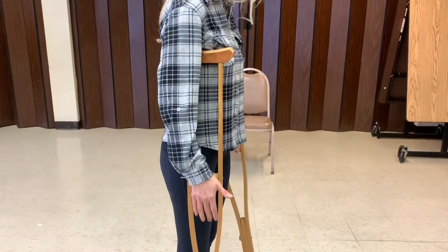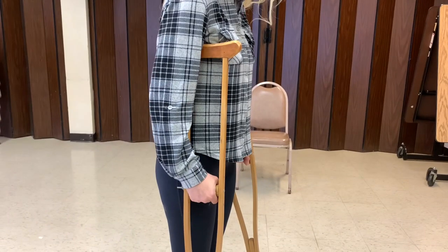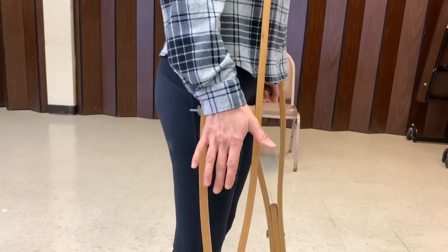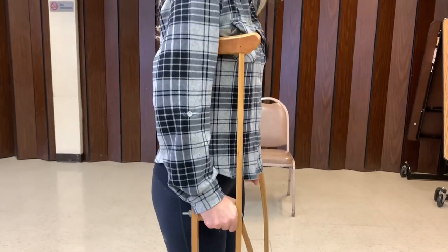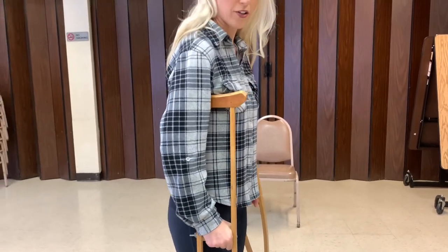So these are adjusted to my height at the armpits. The hand grips should line up about where your wrist hits. So that's pretty comfortable there for me. When you're using the crutches, you want to have a slight bend in your elbows.